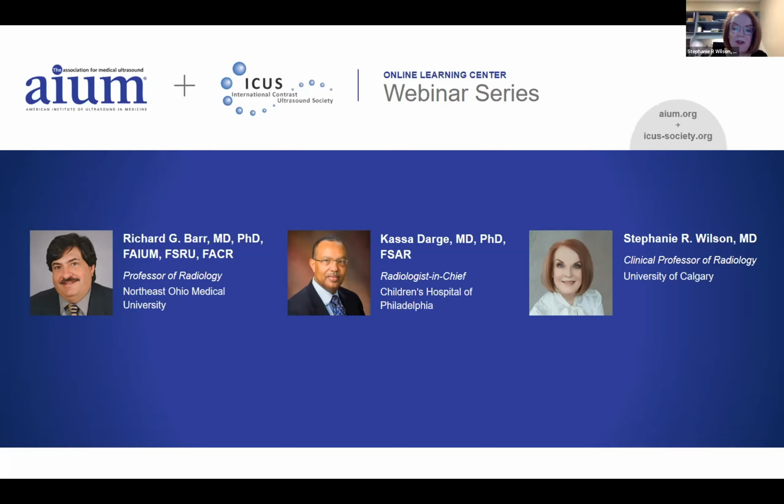And another question, anyone using CEUS for aortic graft leaks? So I'll speak to that actually. When I was in Toronto before I came to Calgary, that was in 2007, I was totally hooked on doing CEUS for aortic graft leaks. Since I've come here, the vascular surgical specialty is not in my hospital, and so I don't do it. But yes, the people in that institution use it regularly.